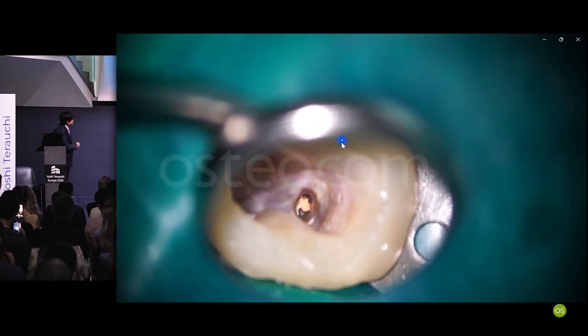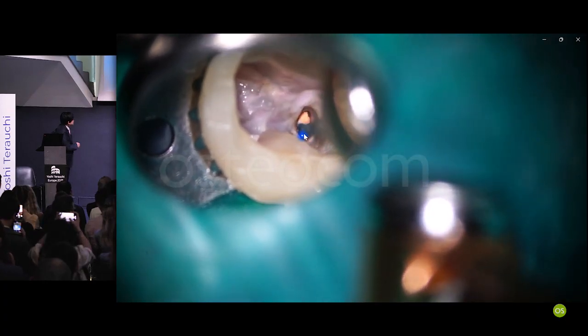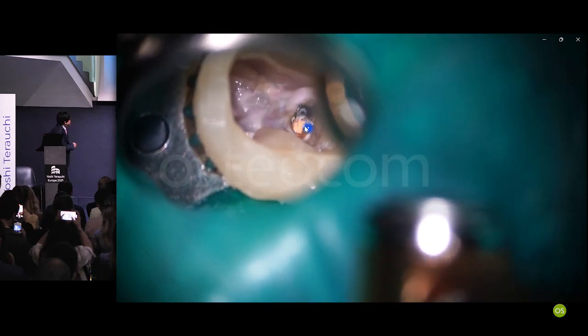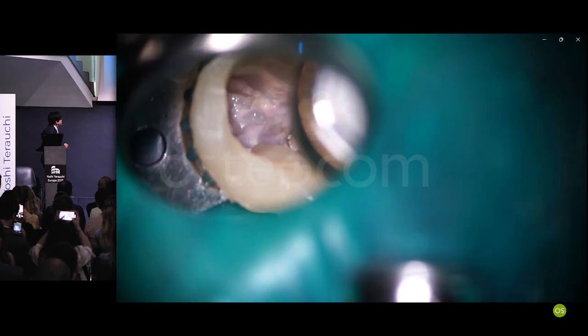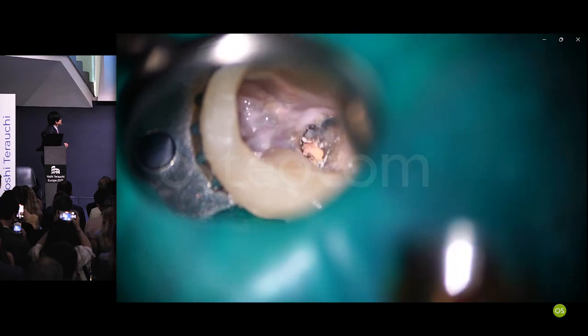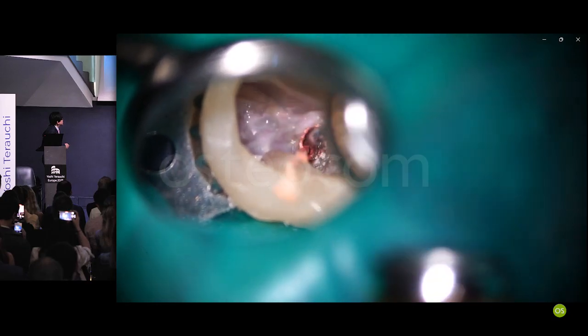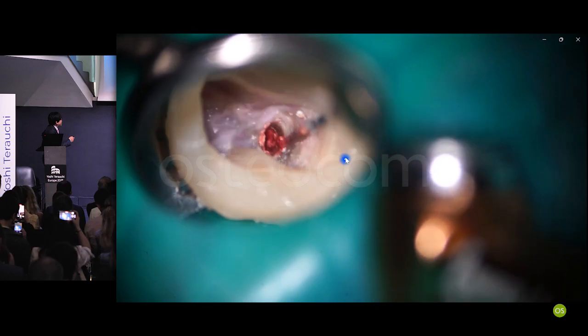And this is the gutta percha. First, I created the space between the gutta percha and the root canal wall. Here comes XP shaper, hoping to get it out in one piece. Up and down, and gutta percha is coming out. Thank God it came out in one piece.